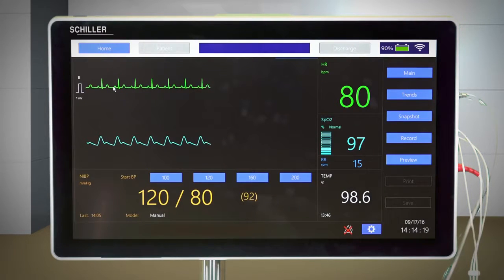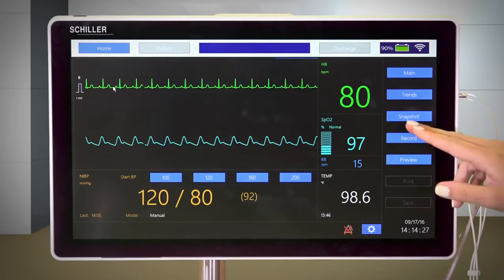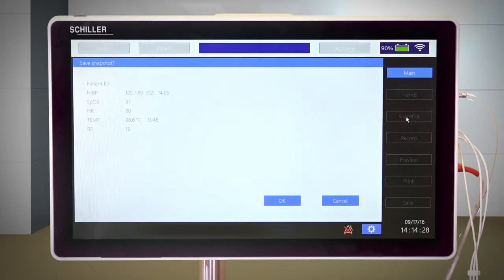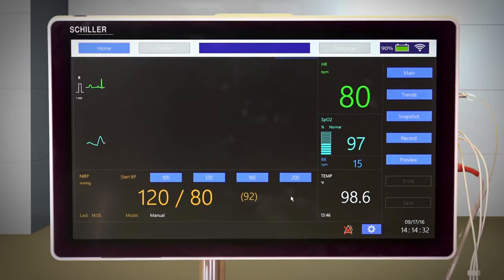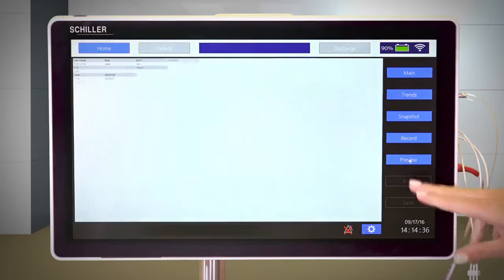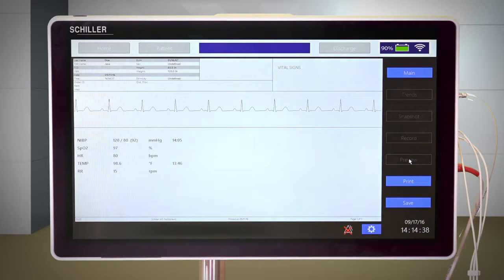The Vital Sign screen displays all current parameter values. By pressing Snapshot, you can save a snapshot of all current parameters at any given time and review them later, or press Preview and generate a report that will include the patient information, an ECG strip, and parameter values that can be saved and accessed in the future.